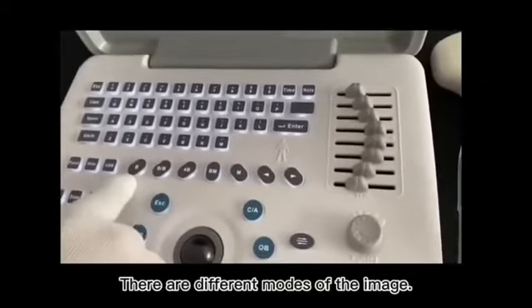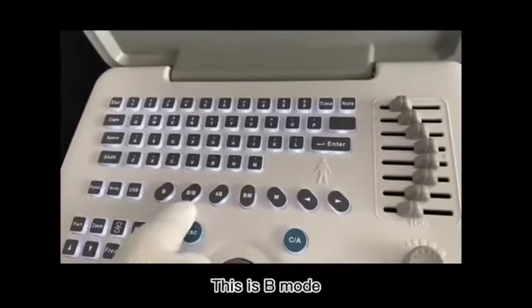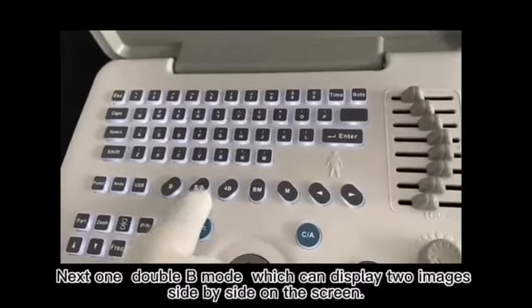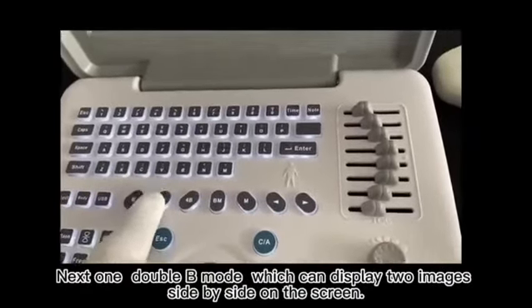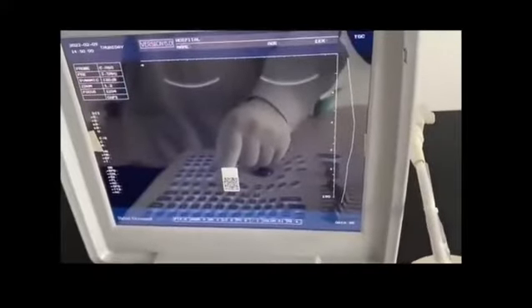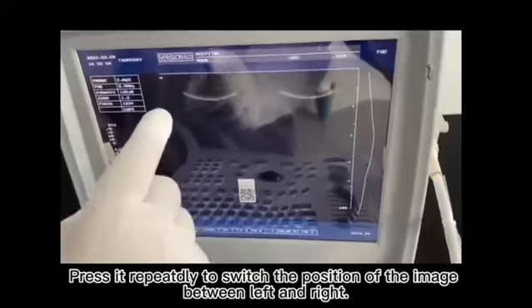There are different modes of the image. This is B mode. Next one, double B mode, which can display two images side by side on the screen. Press it repeatedly to switch the position of the image between left and right.